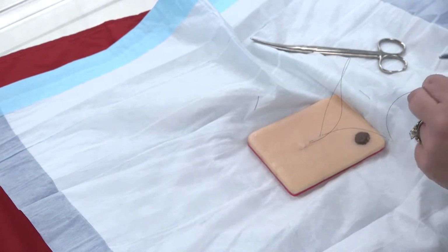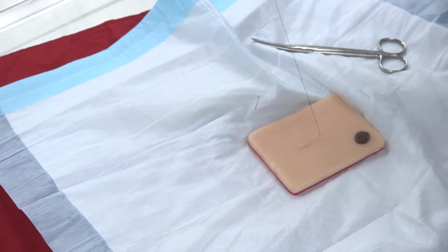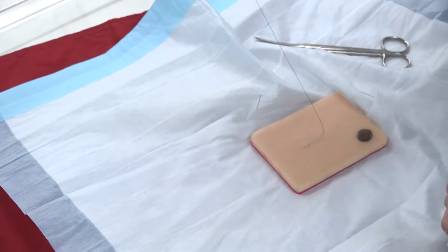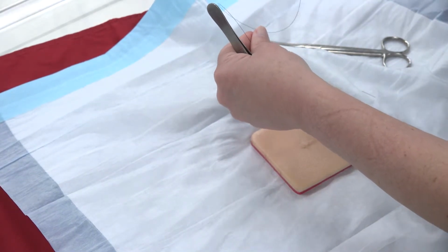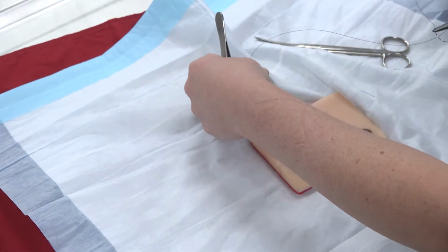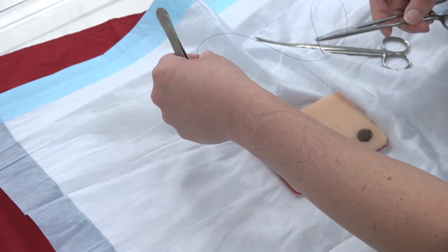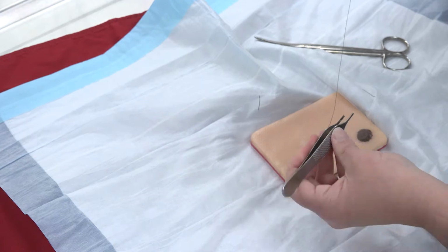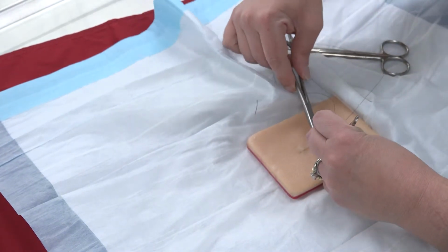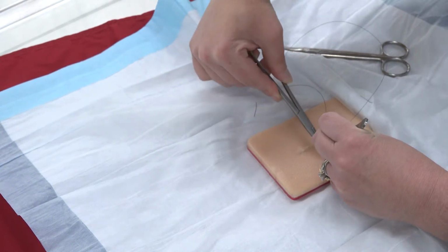All right, now what we're going to do is bury the last knot, and to do that you need everything to be deep. So you need this line, which is now coming out superficial, to be deep. So how am I going to get this to be deep? Well, if it's on the opposite side, I can go superficial to deep on the opposite side. I typically don't like doing that. I don't know why. It's probably just me. But I like coming on my side first.